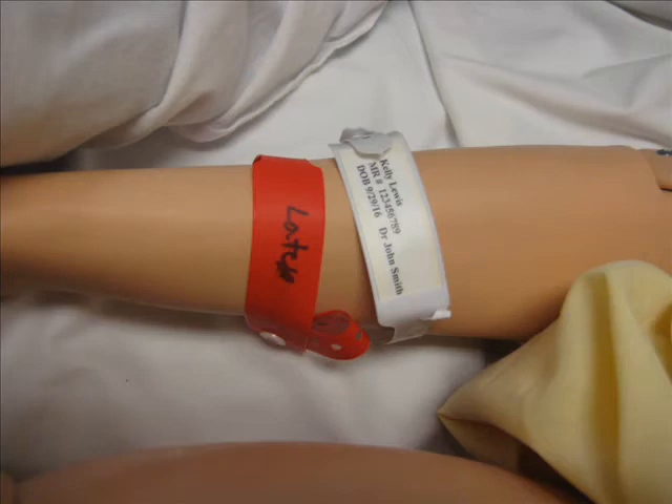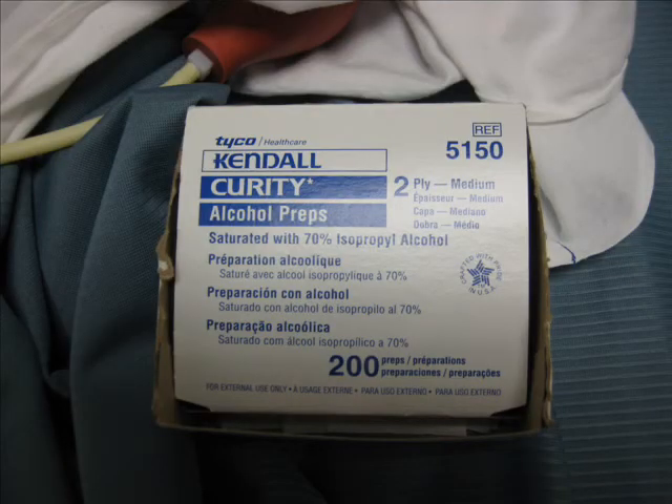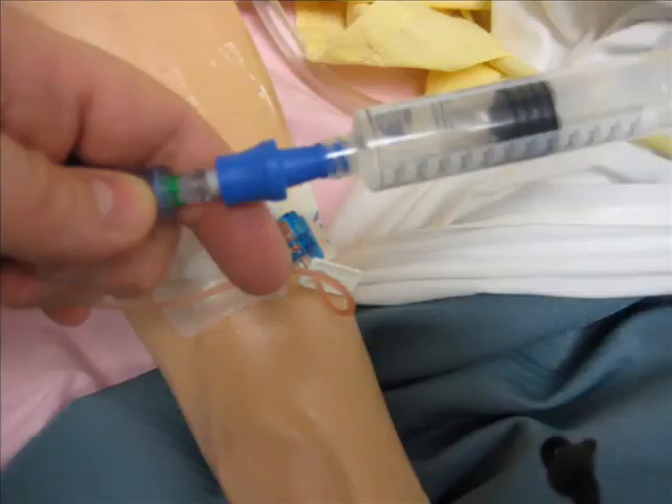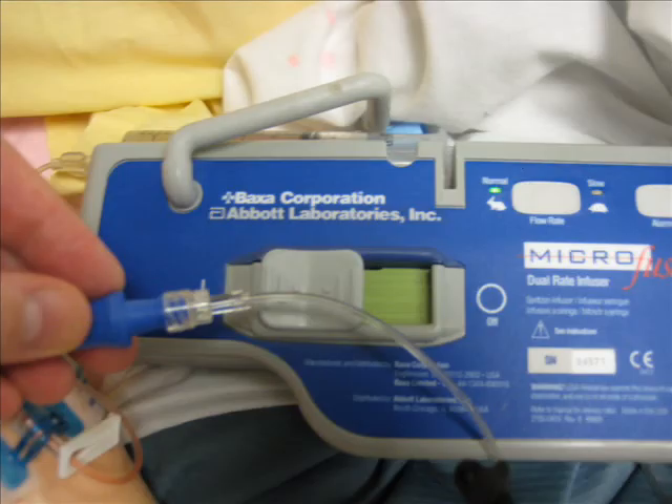We will identify our patient and assess the skin around the saline lock for any redness, inflammation, or anything abnormal. Using the alcohol swab, we will clean the port of the saline lock and attach the saline flush to flush. After that, we attach our line and press the button to run.